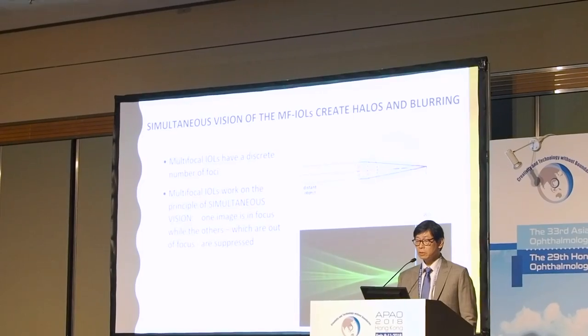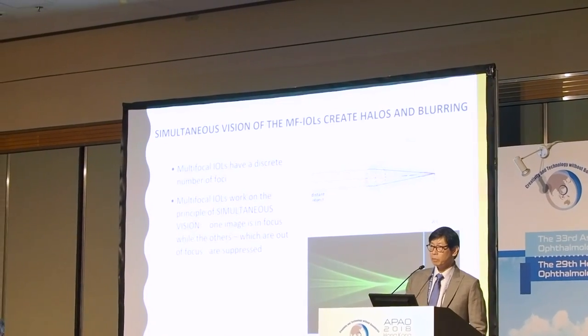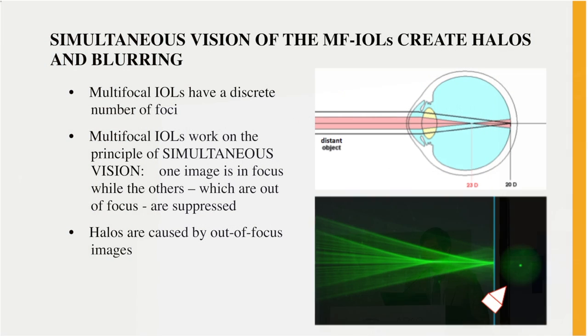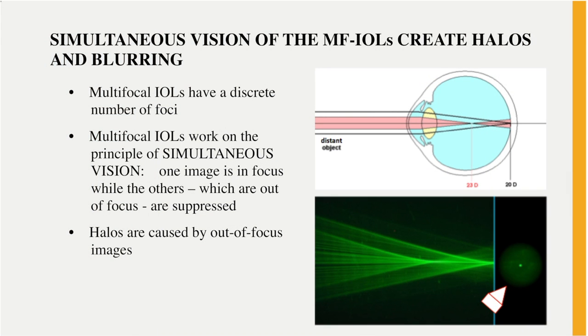And that would also be the reason why, when SIFI approached me, I was a little bit hesitant to join the study. Because I also knew, having looked back to find out the reasons for these problems, about the problems of multifocals. And as Chris showed earlier, the multifocals have discrete focal points, foci.